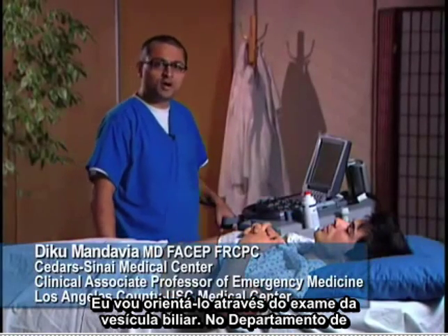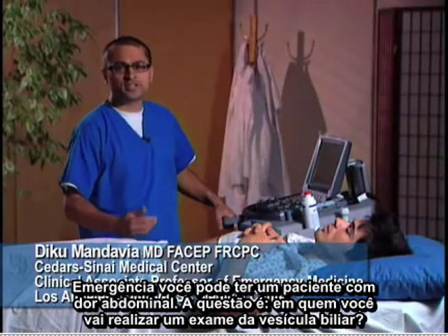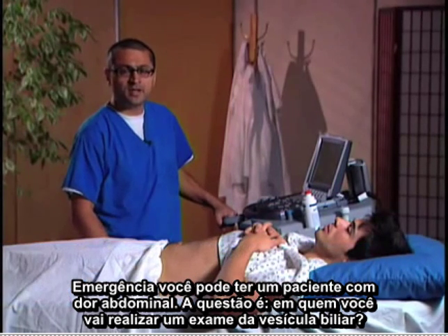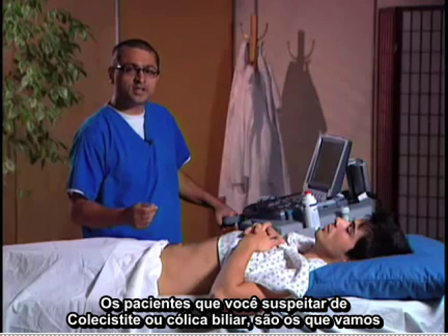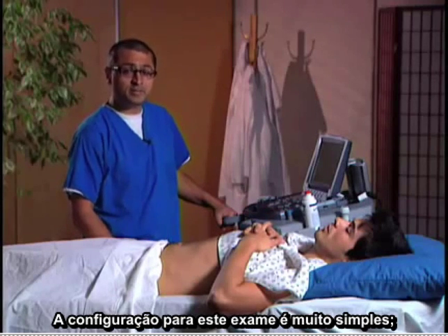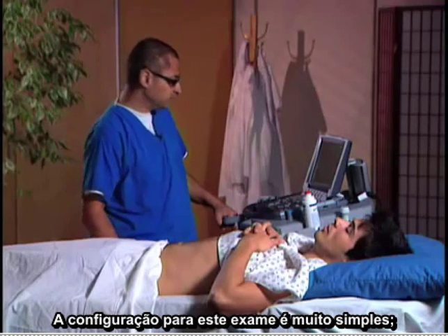Okay, I'm going to take you through the gallbladder exam. In the emergency department, you may have a patient with abdominal pain. The question is, who are you going to do a gallbladder exam on? The patients that you suspect cholecystitis or biliary colic are the ones that we're going to primarily be doing this exam on. The exam setup is very straightforward. Let me take you through it.